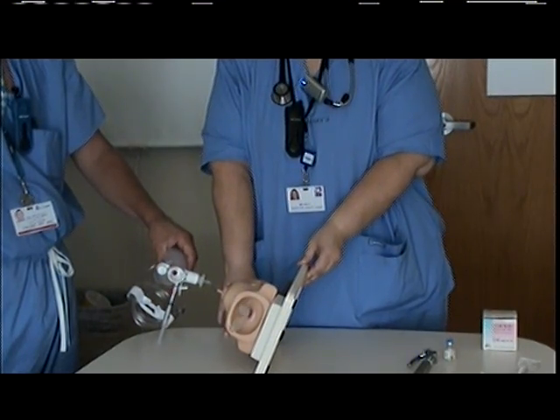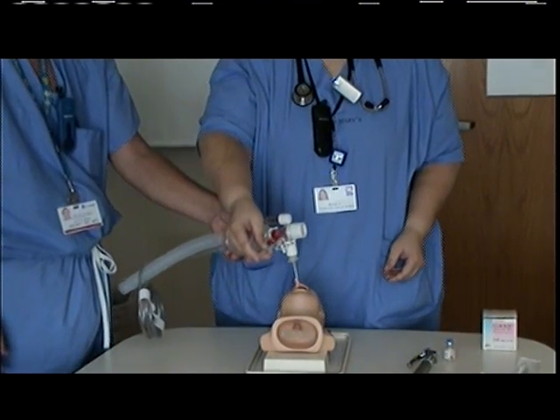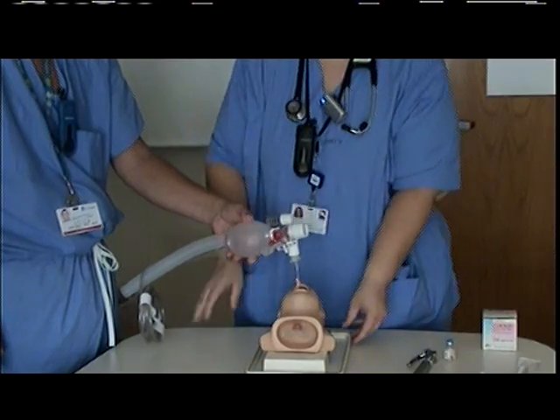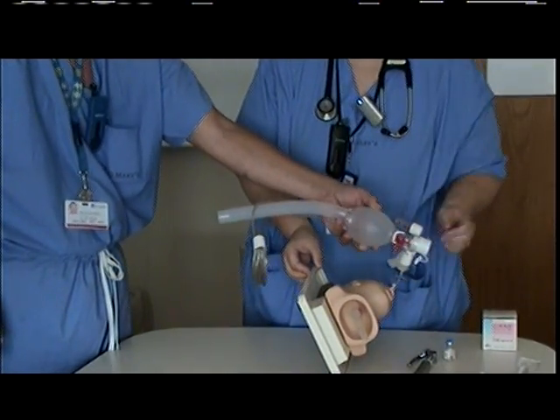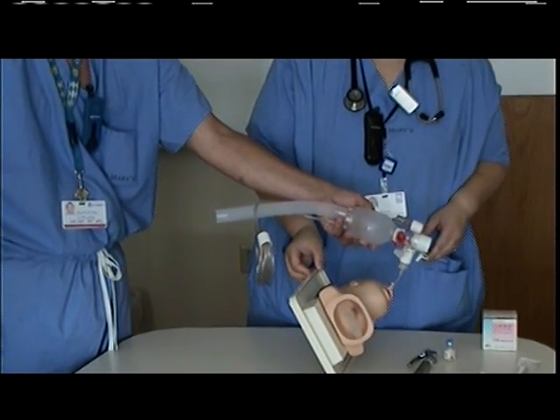You are then going to return the infant to the supine position, administer the remaining dose of CuroSurf, continue to ventilate, and then place the infant on his left side and ventilate for one minute, continuing to monitor the patient's vital signs.